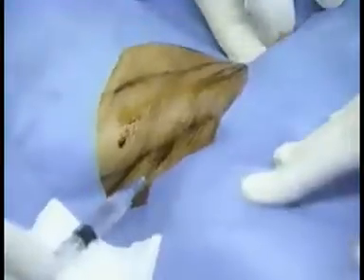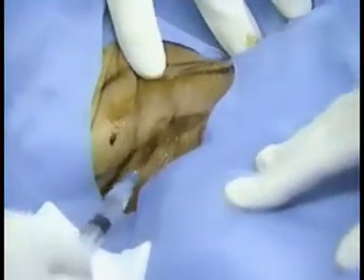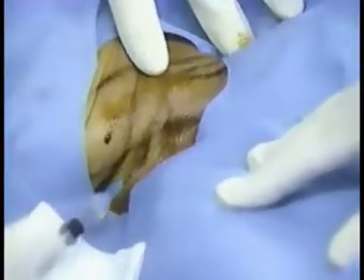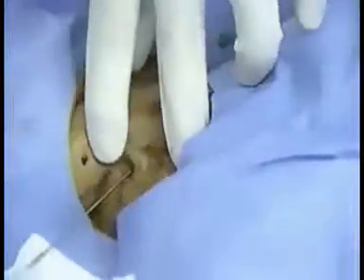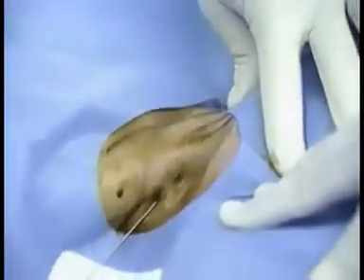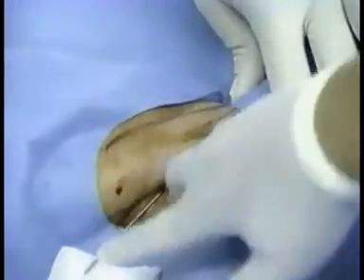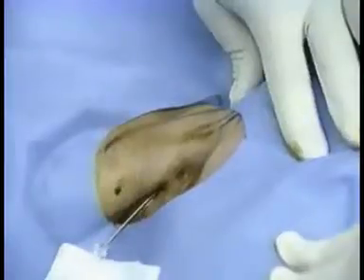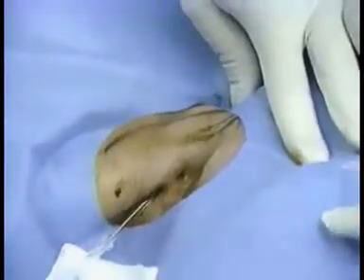This entrance spot may be identified just posterior to where the external jugular vein crosses the sternocleidomastoid muscle, or by selecting the midpoint of the muscle. Next, advance the introducer needle posterior to the lateral head of the sternocleidomastoid muscle. The needle is directed slightly anterior toward your thumb, resting on the suprasternal notch.